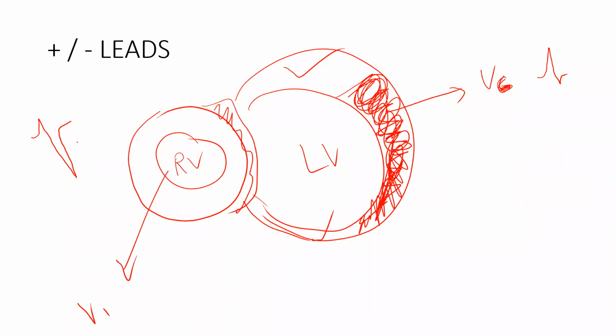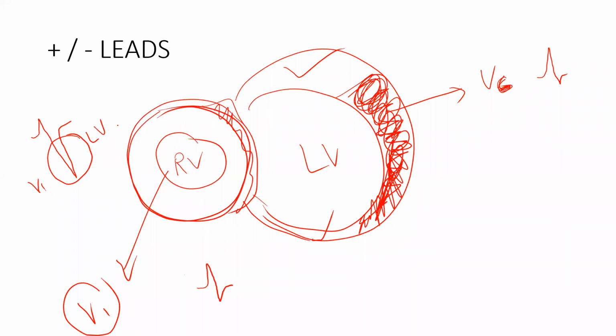So what happens is, that time we discussed, this was the activity shown by LV, right? In V1. This was V1. So what happens in V1 now, because of this myocardial infarction, this becomes small. And because this is overruling now, for example, this was 25 and this was 5, because everything has been dead now, 20 has been dead, like 15 is dead, this is the dead part, we have only 10 here, so now this is 5 here. Now RV is becoming strong and is overruling with electric current, so it is almost equal. See, this positive wave was due to your LV activity only. Now because this much is dead, what we have here in V6 is a small one, but the negative wave is predominating.